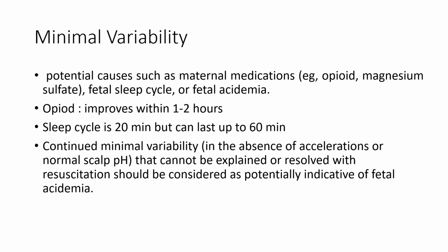Minimal variability can be seen in some situations like a fetal sleep cycle, or most importantly in fetal acidemia, and of course with some medication like magnesium sulfate taken for preeclampsia and eclampsia, and opioid and drug overdose.